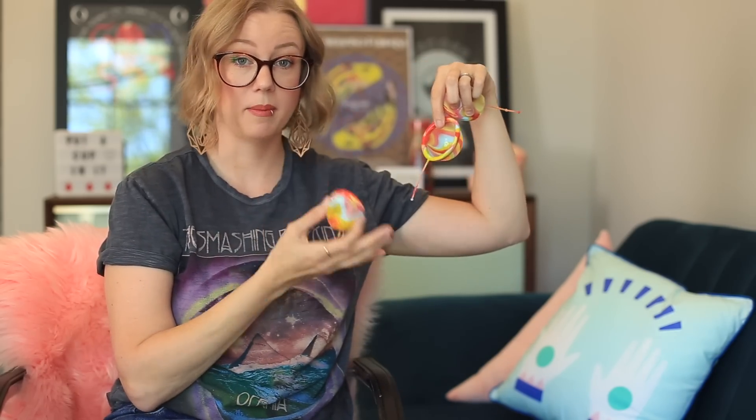Luma has measurements on their website and we have a menstrual cup comparison chart. Discs are reported to hold more than cups, but it really varies per person — it's probably not going to sit like a full bucket. It does just sort of tuck in, so it may or may not hold nearly as much as you expect, but it still has really good capacity and is good for people with fairly heavy flows, unless you're looking at the smaller Luma sizes where capacity will go down.